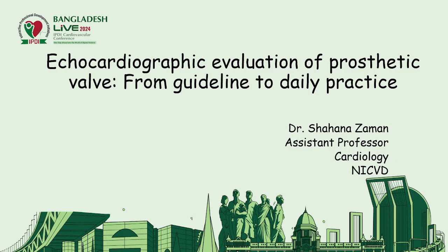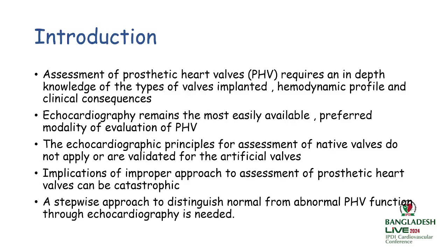My today's topic is echocardiographic evaluation of prosthetic valve from guideline to daily practice. Assessment of prosthetic valves requires an in-depth knowledge of the types of the valve implanted, hemodynamic profile, and clinical consequences. Echocardiography remains the most easily available, preferred modality of evaluation of prosthetic heart valve.